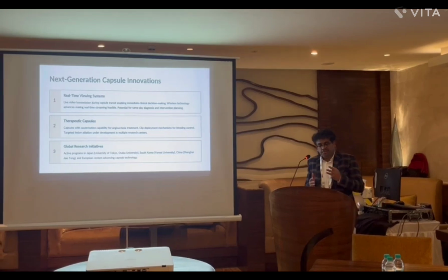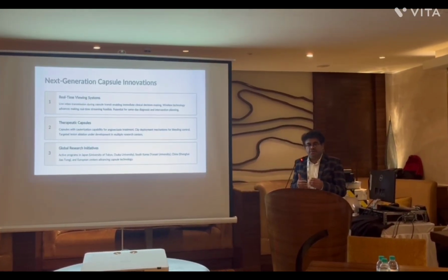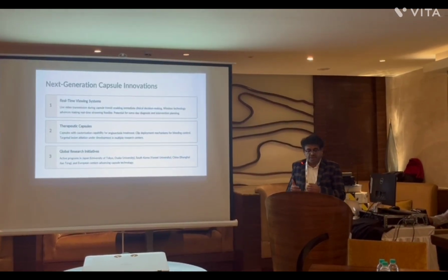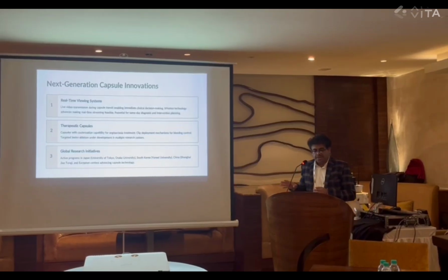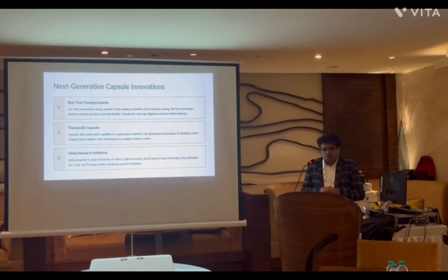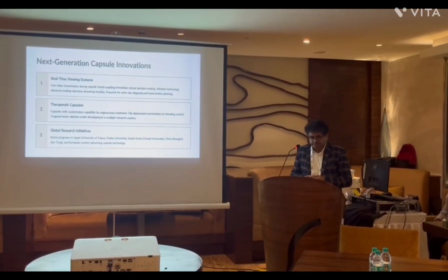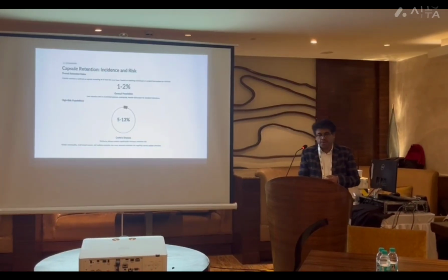One is a real-time viewing system, in which we can automatically and simultaneously identify what is happening in the gut. Rapid assessment can be done with a real-time viewer, and therapeutic capsules allow bleeding control, ectasia management, targeted management, and cauterization. All these things we can try. The global research initiative on capsule endoscopy innovations is mainly happening in Japan, South Korea, and European centers.